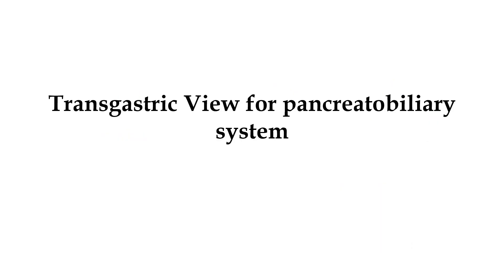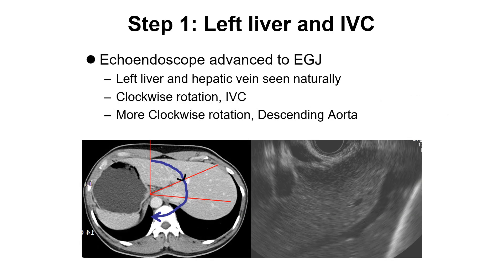I will show you how to observe the pancreatic biliary system by transgastric route. Step 1: Left liver and inferior vena cava. When the patient is lying in the left lateral position, scope is advanced to the esophagogastric junction, and the transducer will be pointing to the anterior side. On EUS imaging, the left liver and hepatic vein can be seen naturally.